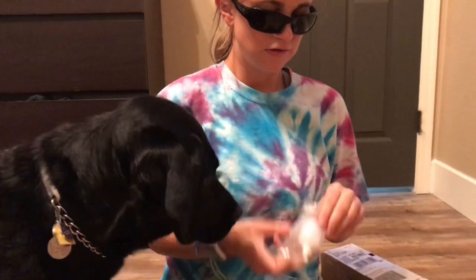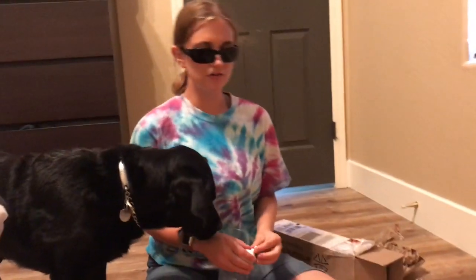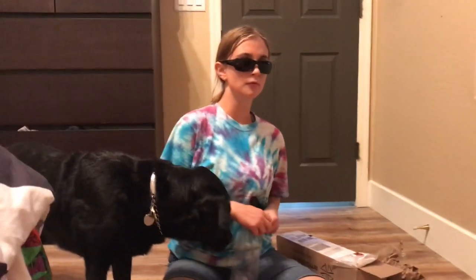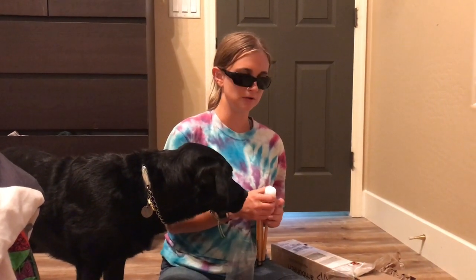So the reason I have so many tips, there's actually a lot of reasons. Number one, I wanted to figure out what tip was actually going to work best. For years I used a rolling ball tip, but that tip is very heavy if you are not familiar with canes. So I wanted to figure out what tip was going to be best. And Aambutech for some reason has a thing where you need $50 or more in your cart to even check out, which is kind of ridiculous, but whatever.